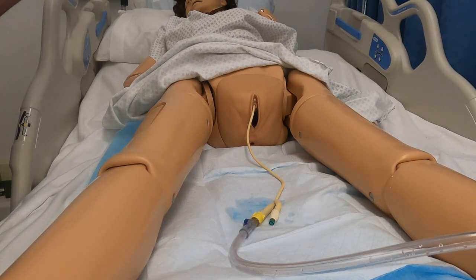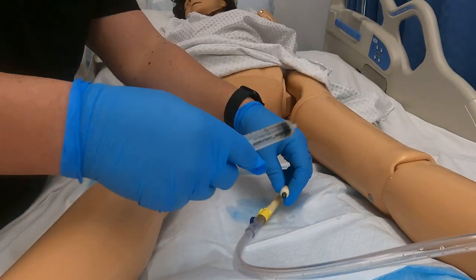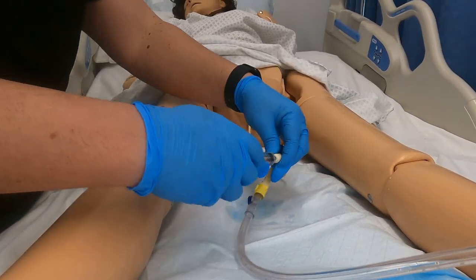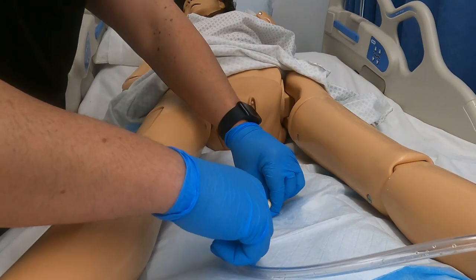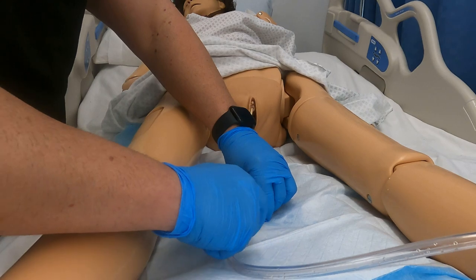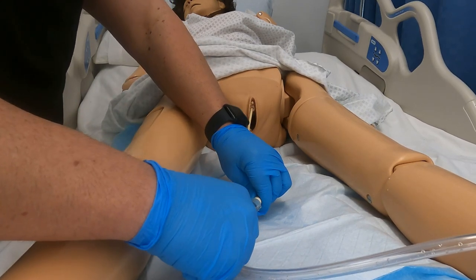Done my hand hygiene, patient identifiers. I've instructed my patient on what we're going to do. So now I'm going to take my syringe and attach it here. I'm going to go ahead and pull that out. I've already previously checked the chart and I know that there's going to be 10cc of liquid in here, so that's what I'm expecting to be pulling out.